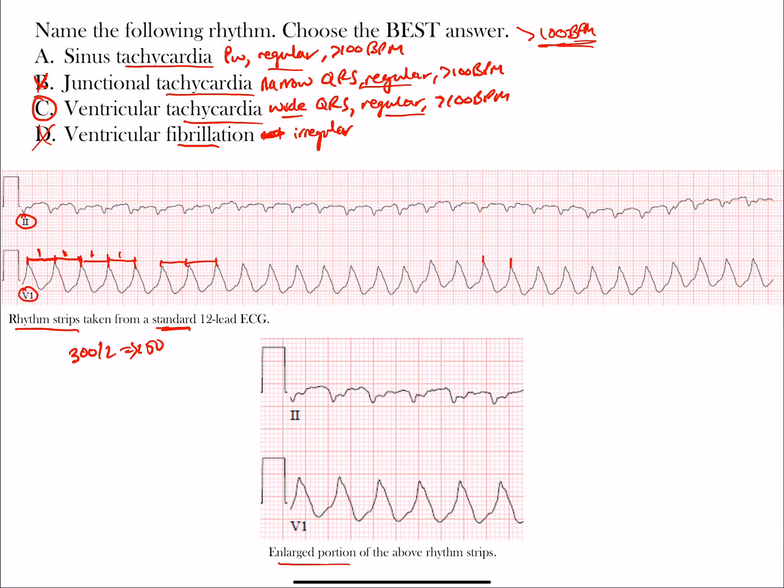This is clearly not a sinus rhythm. You often in sinus rhythm see upright P waves in lead two, and this will be followed by QRS complexes, but you don't have clearly P waves preceding every QRS complex here. I mean, you could have a sinus tachycardia and an AV block, but that's not going on here. We don't see a true sinus tachycardia or sinus rhythm. You don't see upright P waves in lead two where the axis is heading to that positive 60 degrees. Remember, the P wave axis lies between zero and positive 75 degrees. We don't see any biphasic P waves in V1.